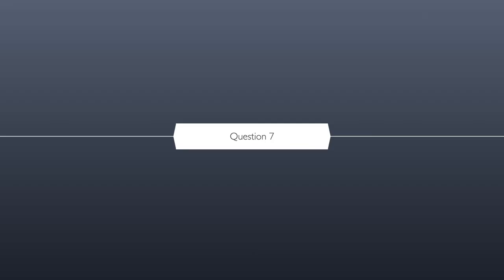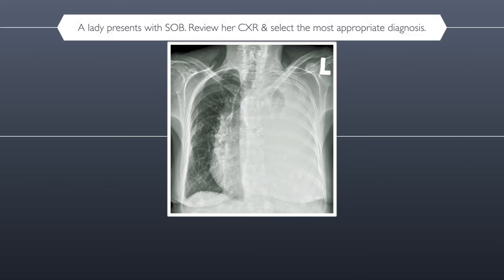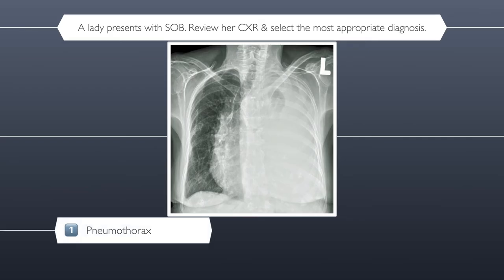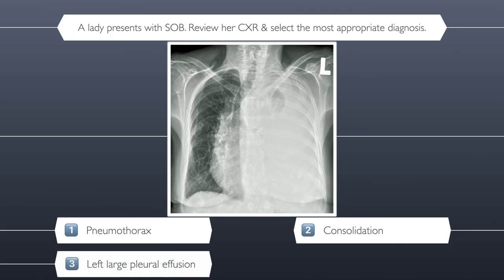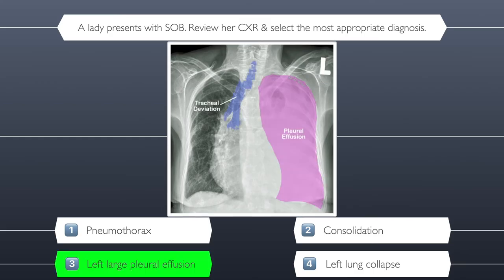Question seven. A lady presents with shortness of breath. Please review her chest x-ray and select the most appropriate diagnosis. Here are your four possible answers: is it number one pneumothorax, number two consolidation, number three left large pleural effusion, or number four left lung collapse? This is the penultimate question and the title of medical legend is within sight. The correct answer is left large pleural effusion.